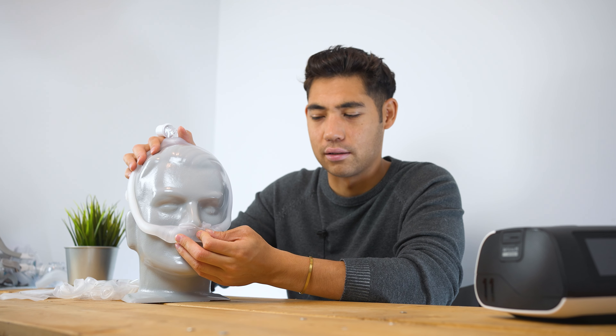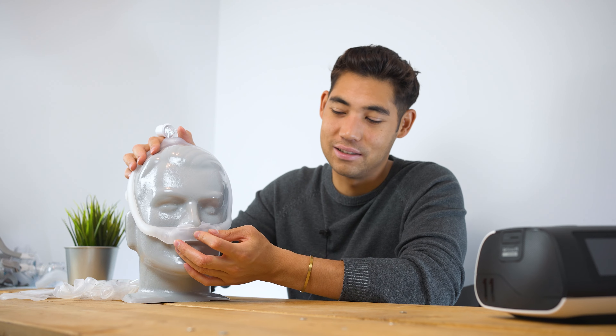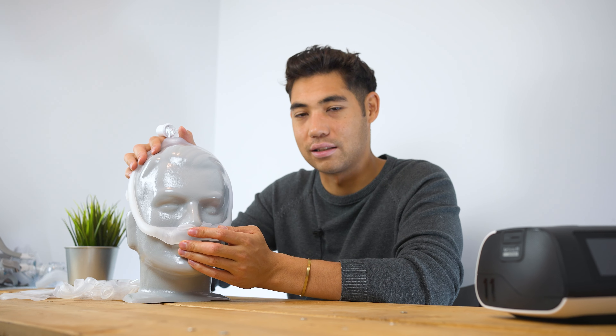At the front we have the nasal pillows — I have a medium wide on right now, which wouldn't normally fit me, but I'll explain why shortly. And then we have an exhalation port, a little dot right there. So that's about it for the walk-through of the mask; now we can talk about it.